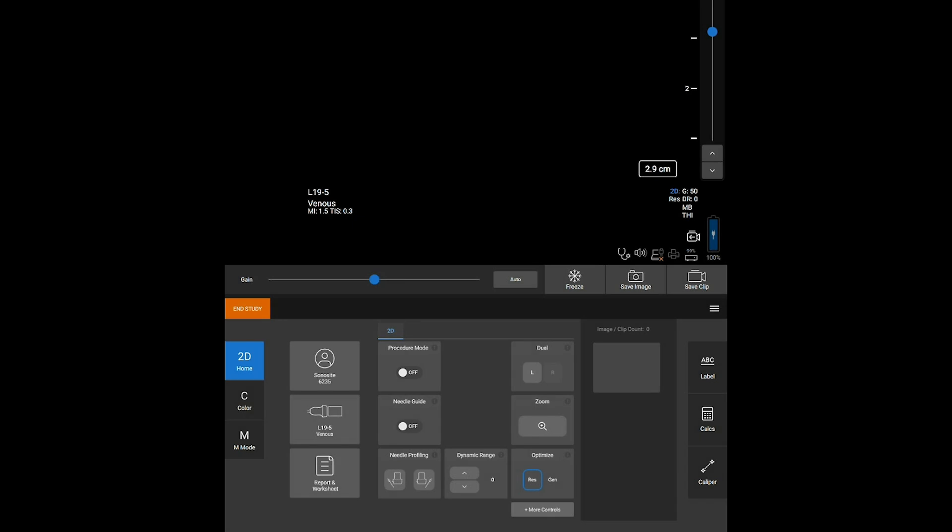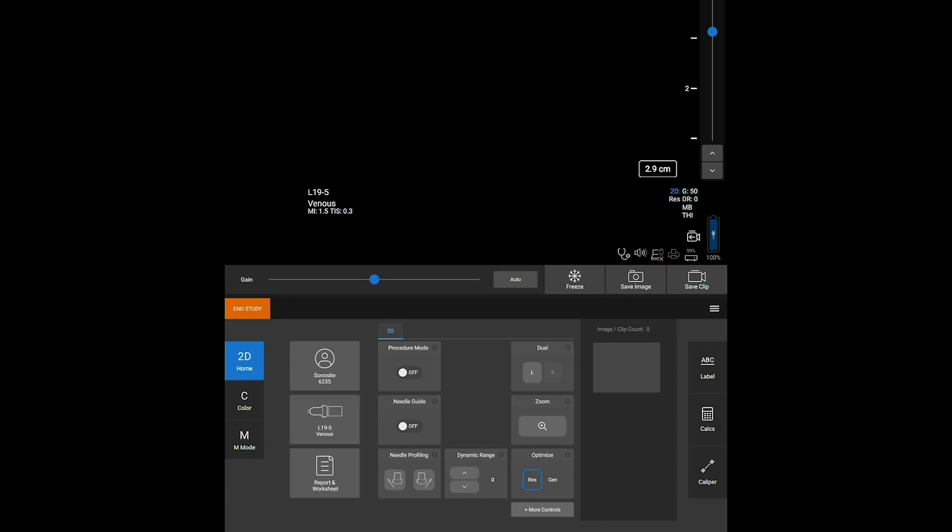No matter what screen you're on, just a few taps will get you to your next task. Everything from entering patient information, choosing a transducer and exam type, and viewing reports and worksheets can all be done easily on the touchscreen.